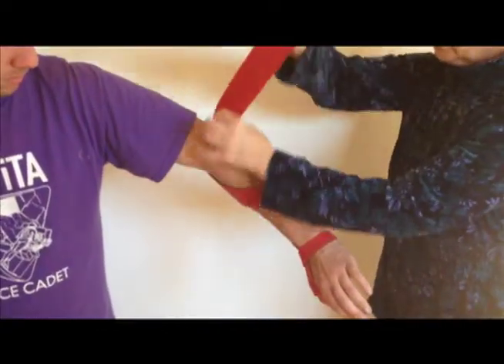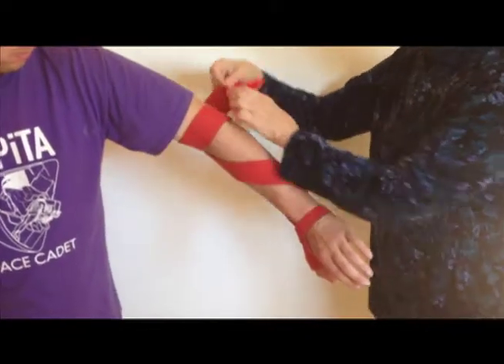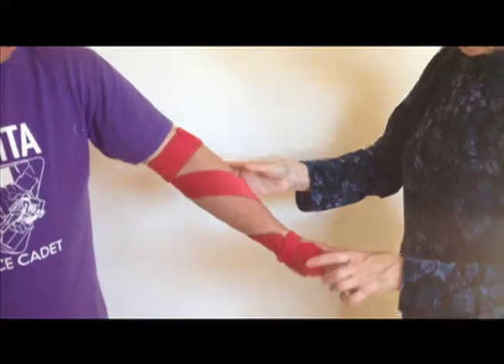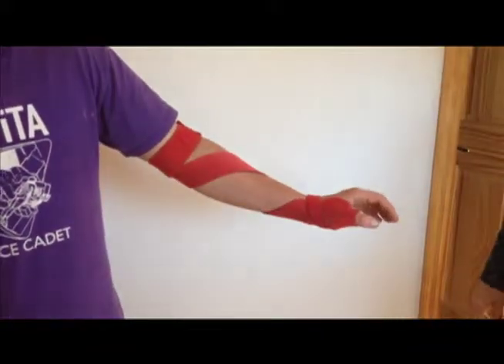Comfortably wrap behind his elbow if I want to assist or block elbow flexion. That's how fast we want to do this.